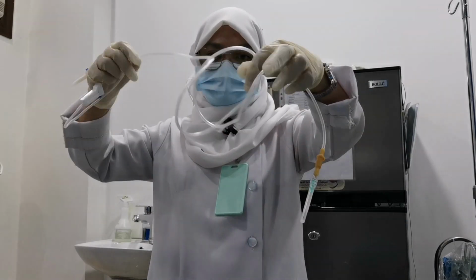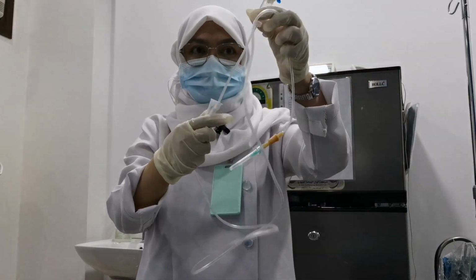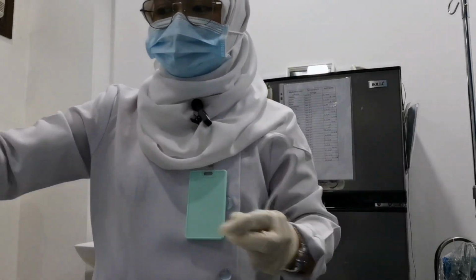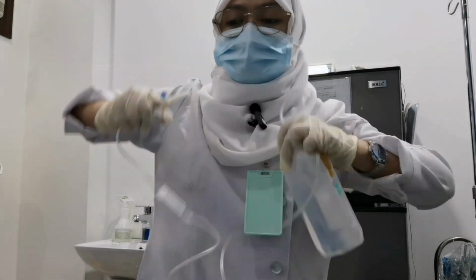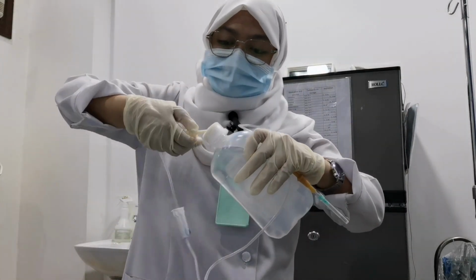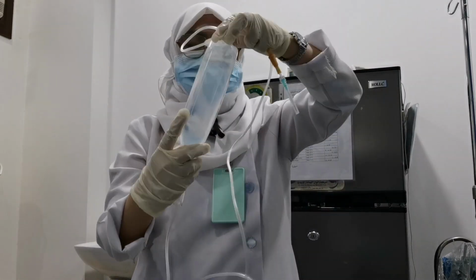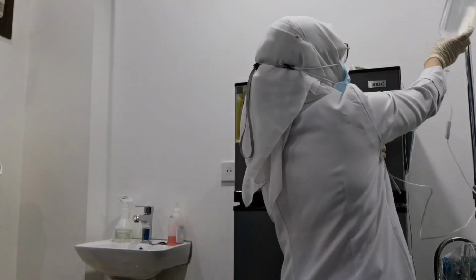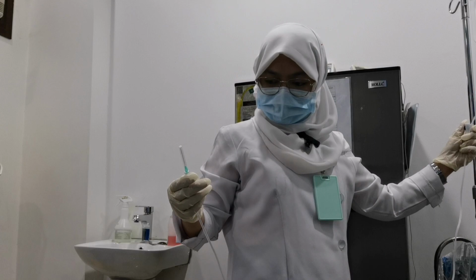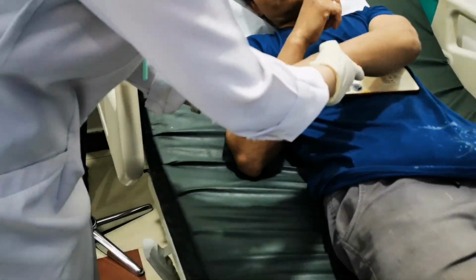Check for coils. Select which site you will use.